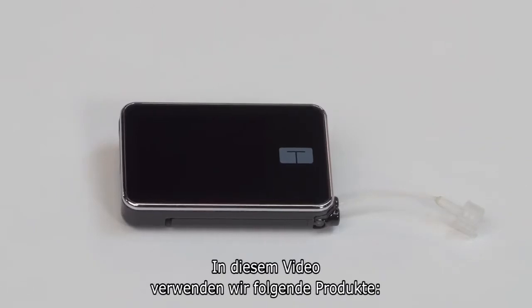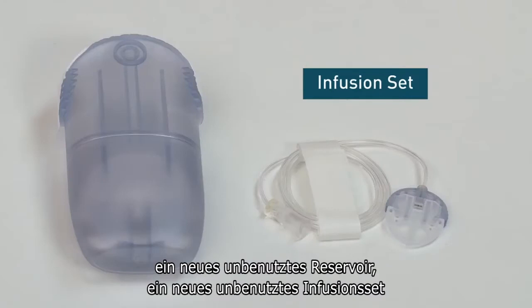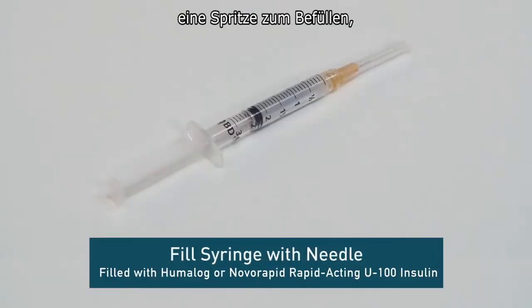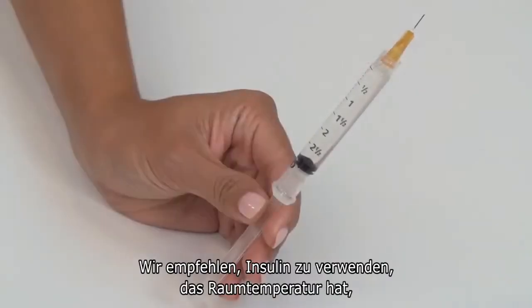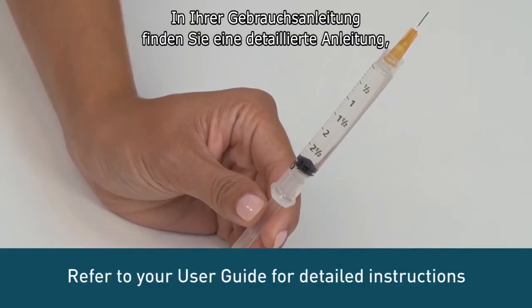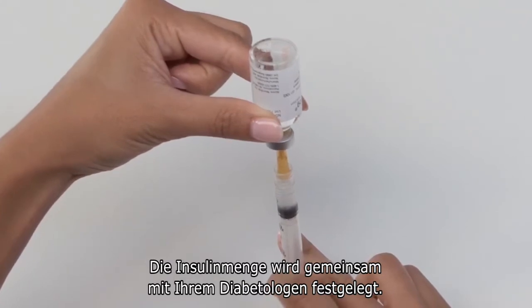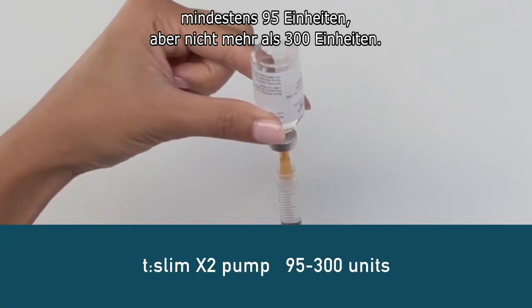In this video we'll be using the following items: a new unused cartridge, a new unused infusion set, a cartridge removal tool or coin, and a fill syringe with needle filled with either Humalog or Novorapid U100 insulin. We recommend using room temperature insulin to minimize the risk of air bubbles. How much insulin you put in will be determined in conjunction with your healthcare team, but a good rule is to fill at least 95 units but no more than 300 units.